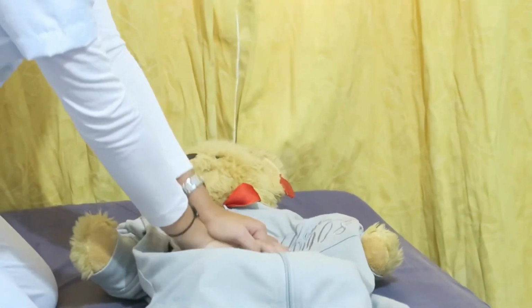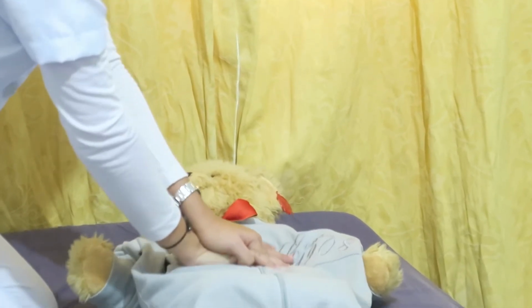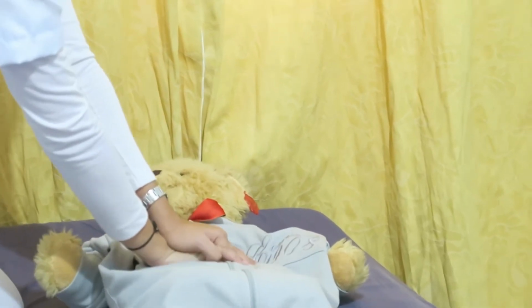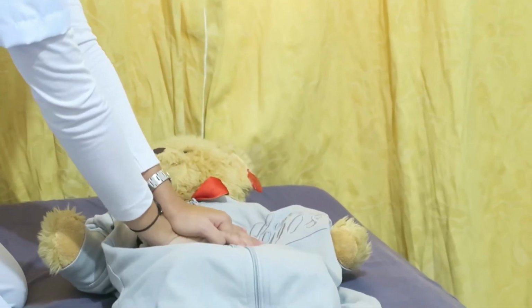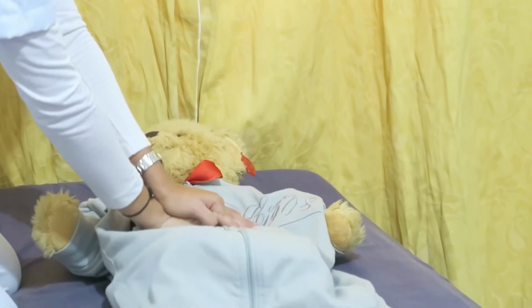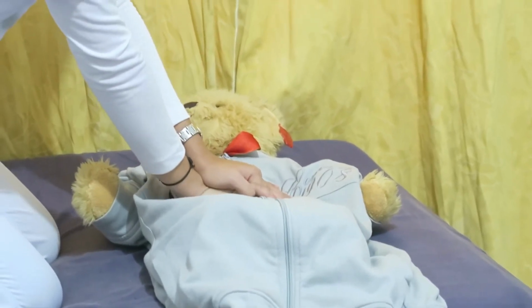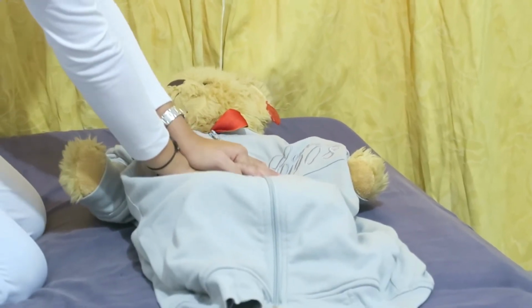While the first rescuer continues the CPR, the help arrived with an AED and a bag mask device. Assuming I am the second rescuer, I arrived at the scene and brought the AED with me. So I will turn on the AED, then attach the pads while the first rescuer is still giving compressions, then wait for the AED to analyze the patient's heart rhythm and wait for the AED to instruct to clear the patient and to press the shock button.